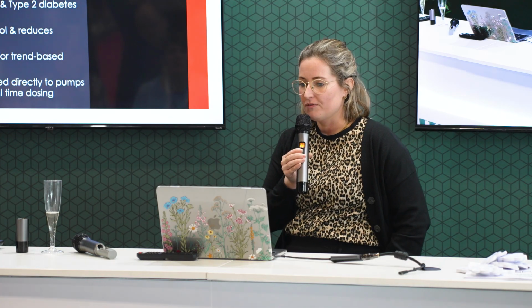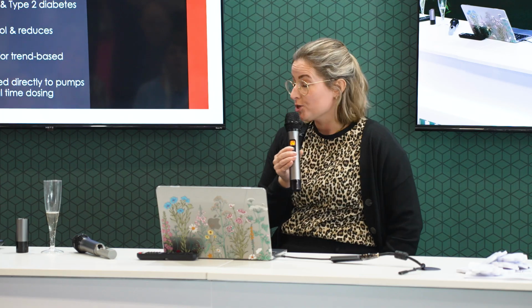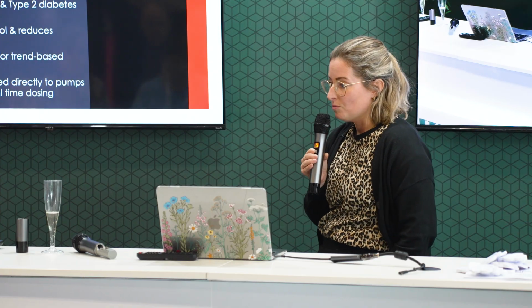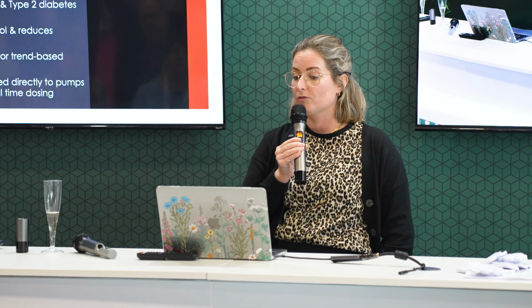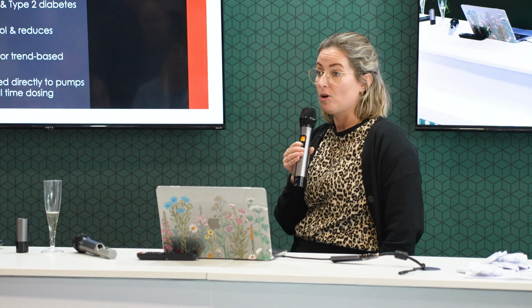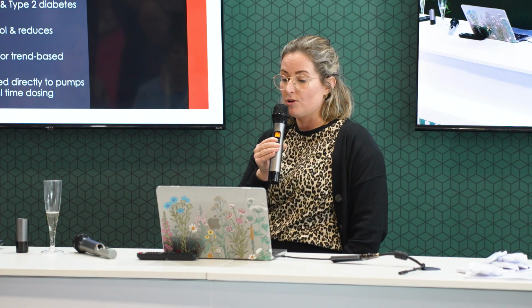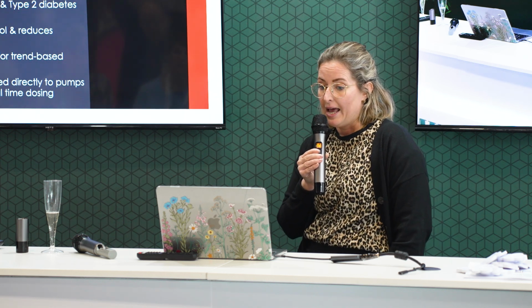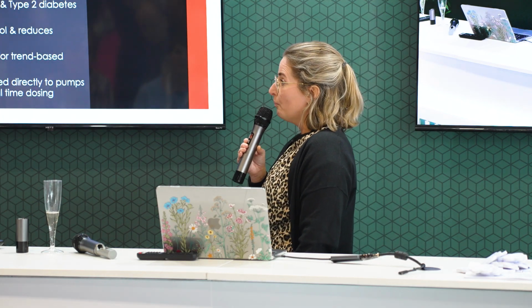Now, if we look at the use of these devices in a human healthcare setting, what we're seeing is that they're used predominantly for type 1 and type 2 diabetic patient management. These are allowing patients to be at home, going about day-to-day normal life, and these devices are going to help us to improve glucose control and reduce any hypoglycemic events, hopefully. There's also a strong evidence base for trend-based decision-making and dosing with, as we said, the integrated use of pumps or perhaps pens. And this is hopefully going to improve with time and become more advanced as technology is evolving.